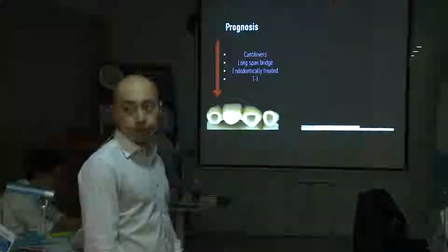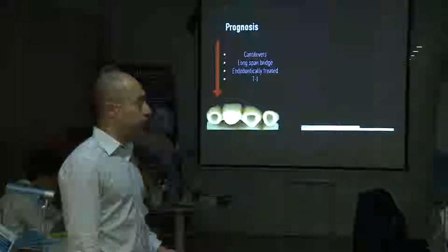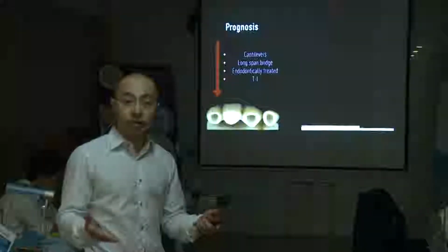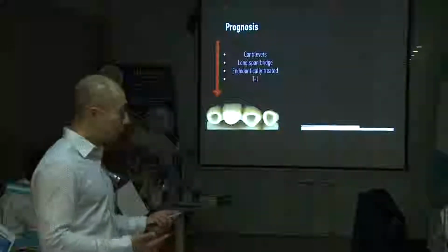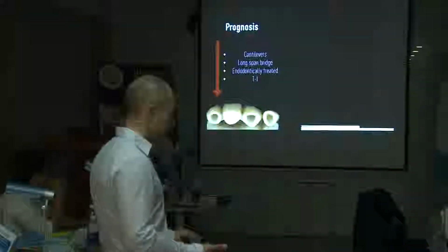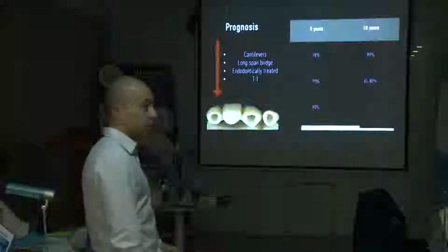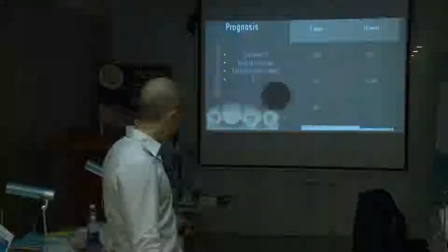So, unless you have two perfect teeth to make a preparation, the prognosis of a bridge is lower than an implant. But when you have two perfect teeth, there is absolutely no reason to grind down the teeth for crowns. Thành ra là cái cầu răng cổ điển nó chỉ tốt khi mình có những cái răng hoàn hảo, nhưng nếu răng hoàn hảo thì mình cũng không có lý do gì để đi mài nó làm cái cầu. And if you recalculate that, our prognosis of bridges dropped to 80%. Thì nếu cái răng trụ có vấn đề về nội nha hay là những cái cầu dài thì cái tỷ lệ sống sót sau 10 năm nó còn 80%.